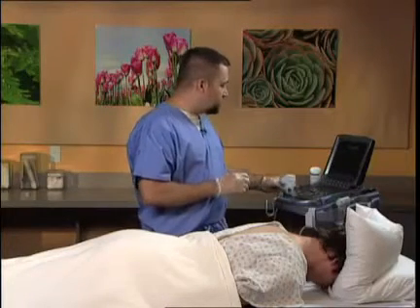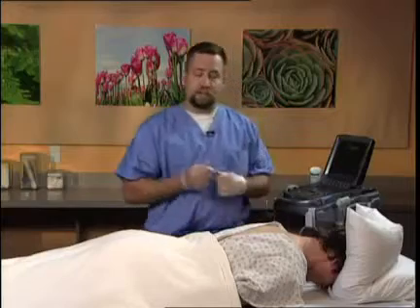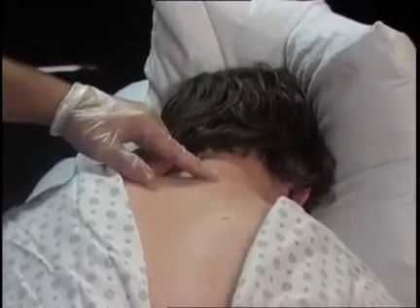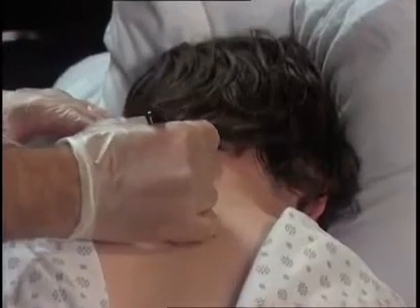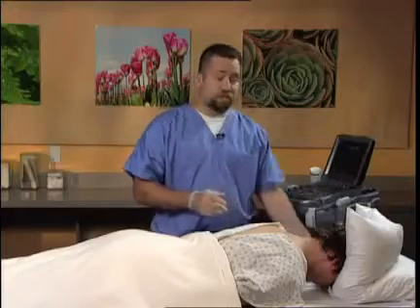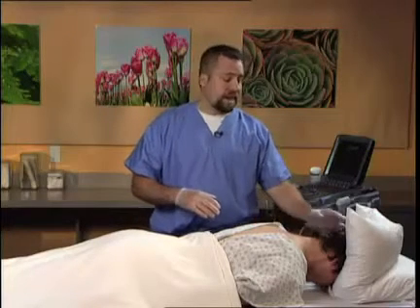On the patient, initially, I like to mark utilizing a Sharpie the C7 spinous process. This is the most easily palpable spinous process, and this is facilitated with the patient in the prone position, a bolster under the thorax, and the head slightly flexed.